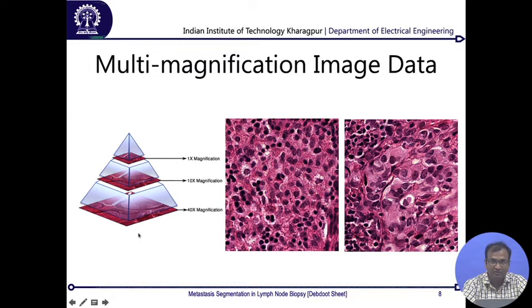of pyramidal decomposition format. So typically images are acquired at multiple magnifications, as we had seen in the lab scale demonstration, that you can have different objectives with different magnifications. So here also on the slide digitizer which we had shown on the earlier slides, you have similar kinds of objectives, and one objective with a different magnification is used at a time.